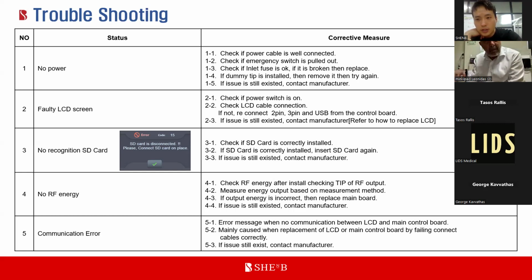In the instruction I will send you after the training, there will be information. But so far, I would say it's not that necessary. But considering that in Greece, for instance, we have more than 50 Vivace in the market, if the customer has been using the Vivace for a sufficient period, sometimes this kind of problem might happen. So it is also recommended to our long-term partners to have this kind of device in their warehouse or their service center to check the RF output. I'll give you an explanation about that later on.